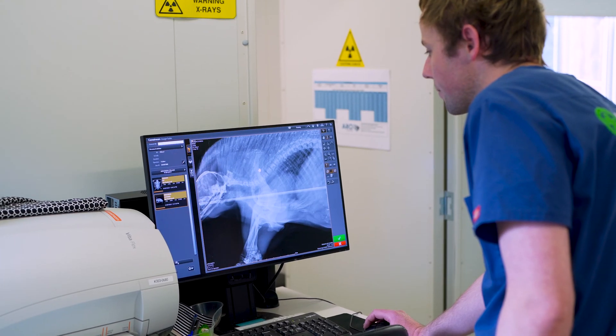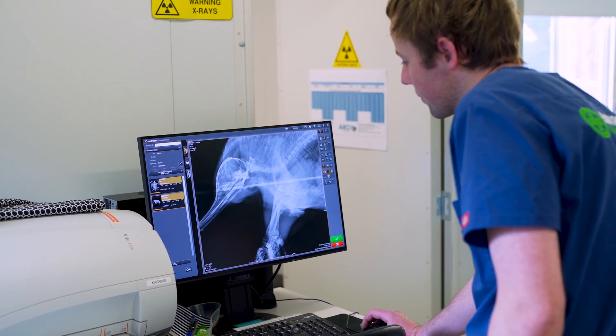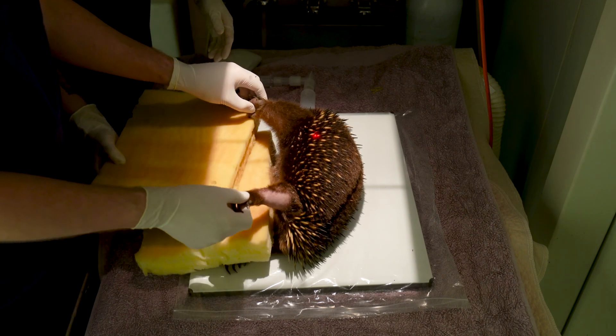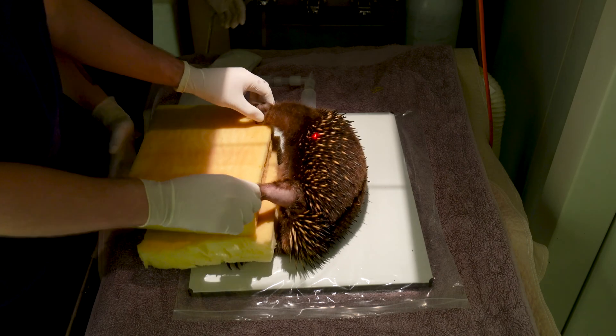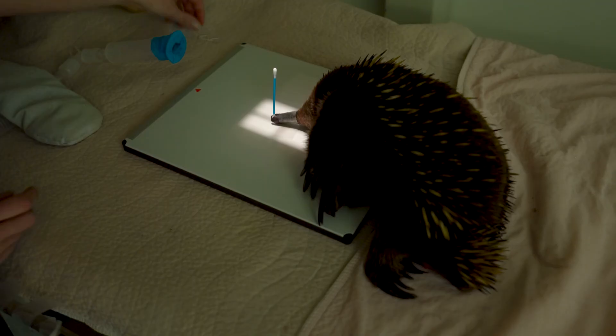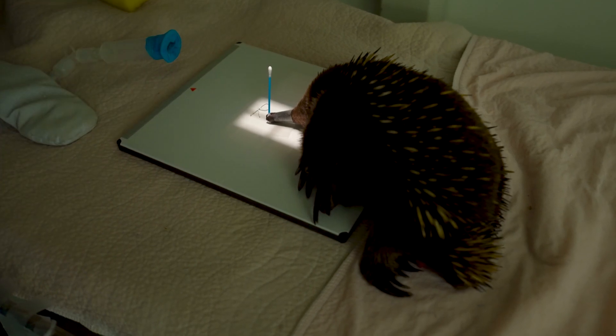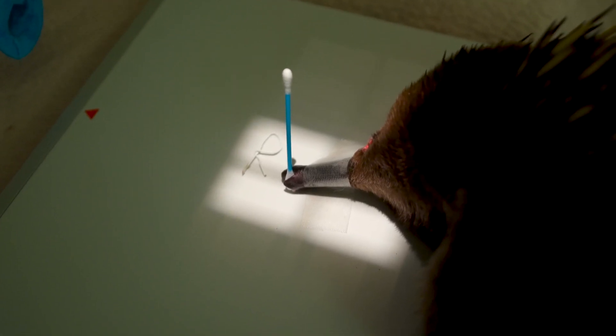When we're taking our lateral shots of the whole body we can use a piece of foam to keep the legs separated, which will keep the whole body on the same plane. And when we're taking a lateral shot of the skull, we can use a cotton tip placed between the two beaks to keep them separated.